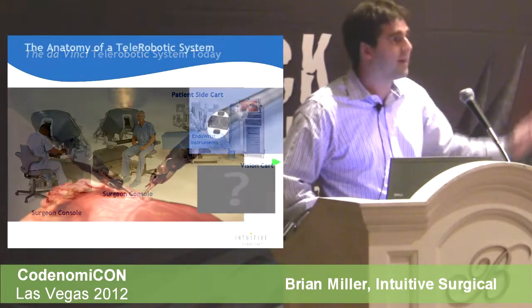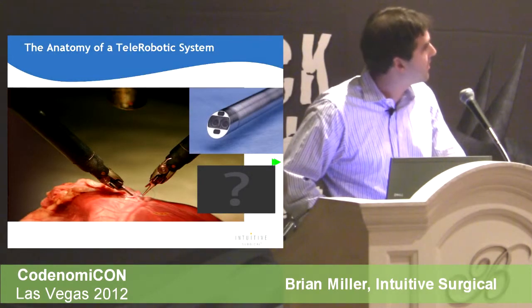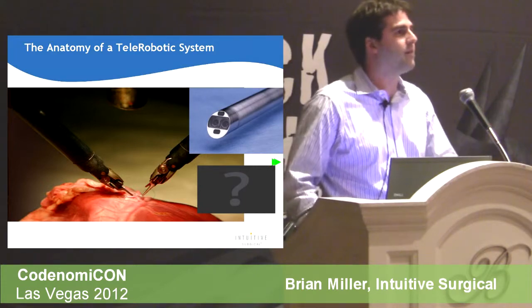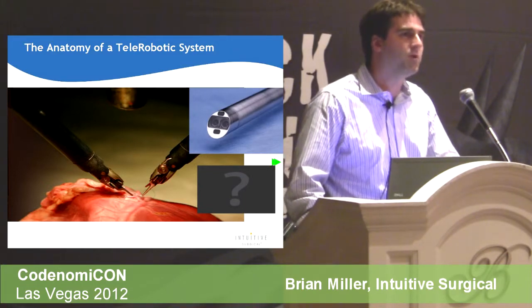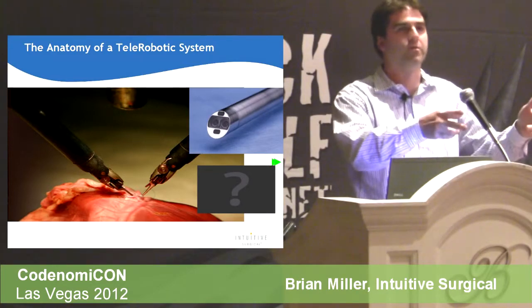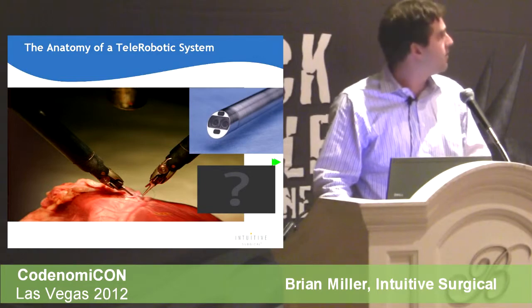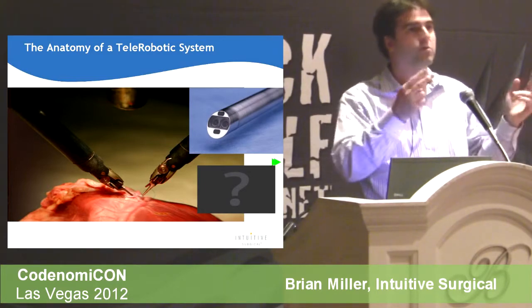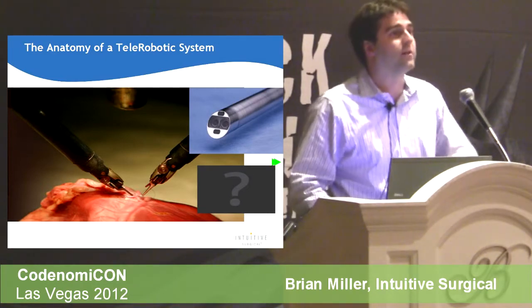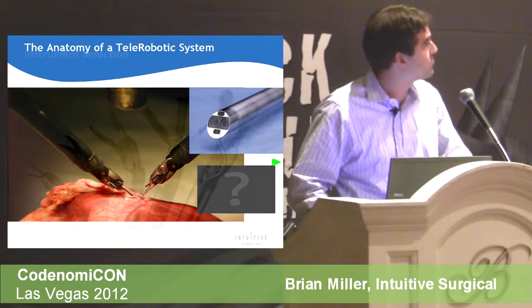What wasn't shown in that last picture is where surgery happens and the devices that enable it. On the left-hand side, those are the robotic instruments. What I mean by a robotic instrument is, unlike the handheld laparoscopic technique, which some of you might be familiar with, where they use what we call chopsticks, you insert the instruments and the only thing you have is grasping. So if you want to reach around some anatomy, you have to move your arms and try to reach the surgical site. With the robotic system, we have full articulation of the instruments, which allows you to reach around anatomy and get to where you need to go. The upper right-hand corner is the 3D view, where we have a dual optical channel, which provides the surgeon with a three-dimensional view.